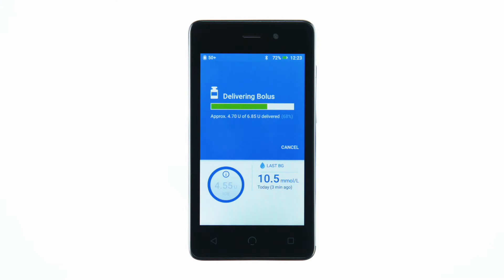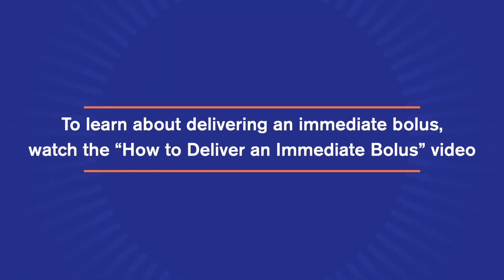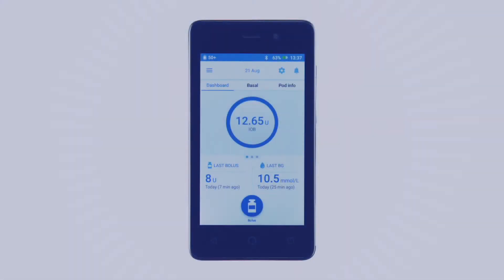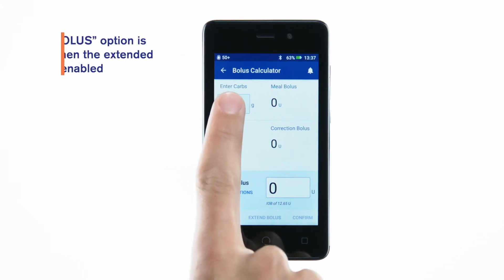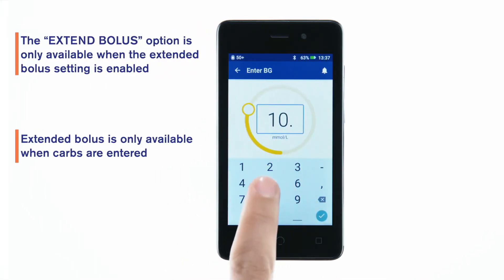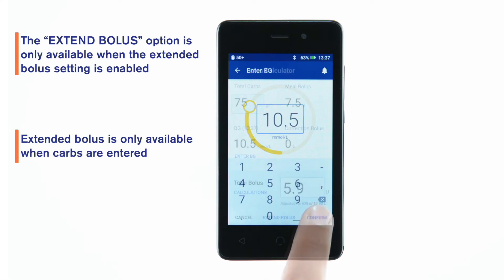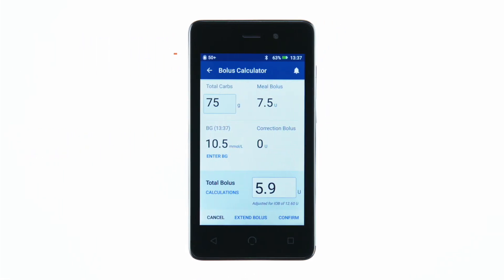The process of delivering an extended bolus is similar to the process of delivering an immediate bolus. To learn about delivering an immediate bolus, watch the How to deliver an immediate bolus video. To begin, tap the bolus button and enter the information as you would for an immediate bolus. Once you've entered the values and reviewed the bolus calculation, tap the Extend Bolus button rather than Confirm.